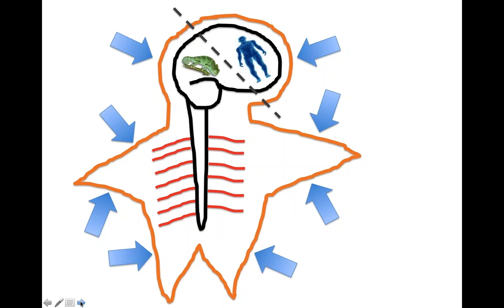And we can mitigate pain through distraction techniques, such as icing and stim and heat and all those other types of passive modalities, or we can use some tooling effects, these feathering effects, these lighter effects, to mitigate the pain and start changing motor output. Just some quick treatment along certain areas to change the motor output, because really movement is going to be the medicine for the brain, and that's what we want to get. We need to get past this idea that passive modalities are doing long-term changes to our patient. We don't see that. Movement is doing great long-term outcomes for our patients.